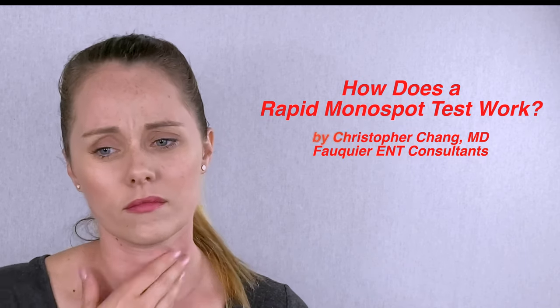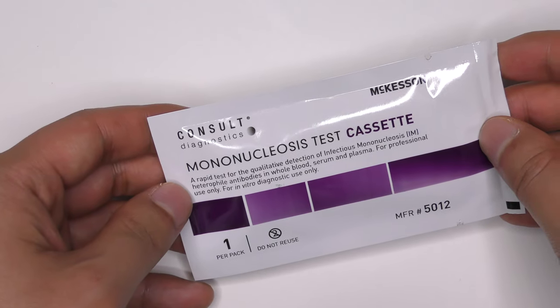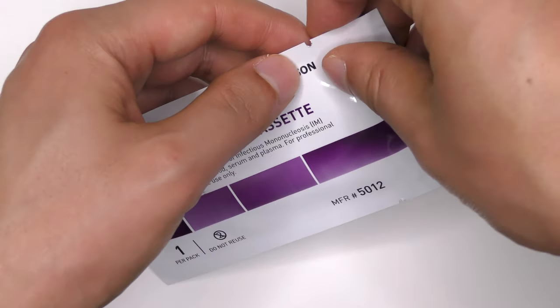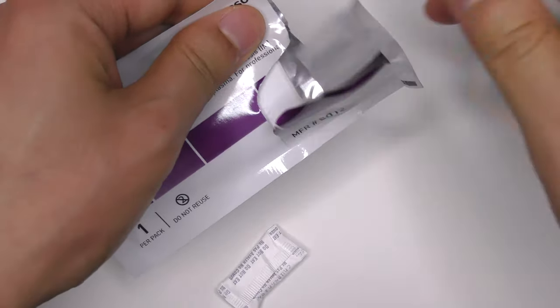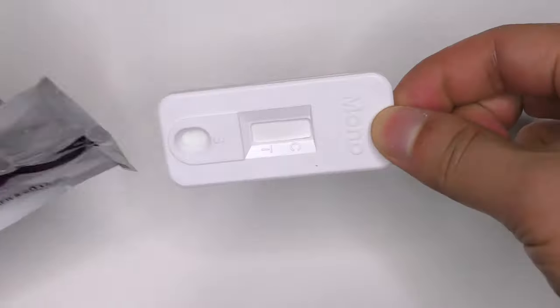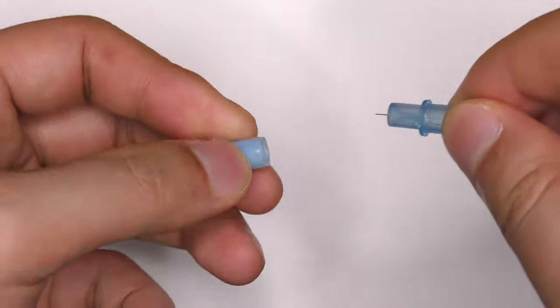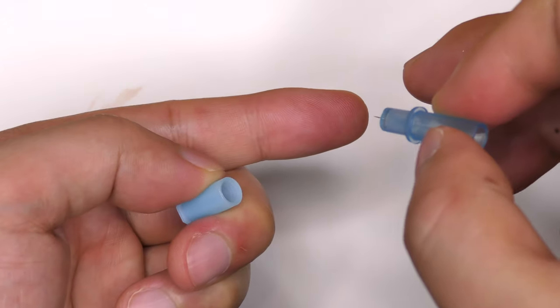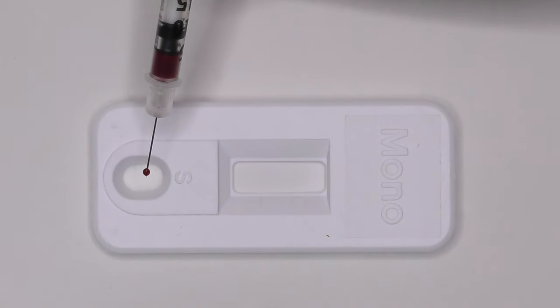When mono is suspected in a patient, a rapid mono-spot test can be performed. This test begins by removing the test cartridge from its pouch and placing it on a flat surface. Whole blood is then obtained either from a finger stick or anticoagulated blood professionally obtained. Here, blood has been obtained by a needle stick.